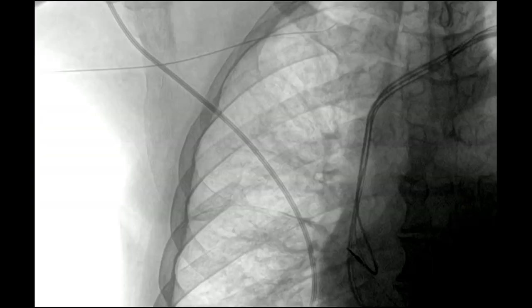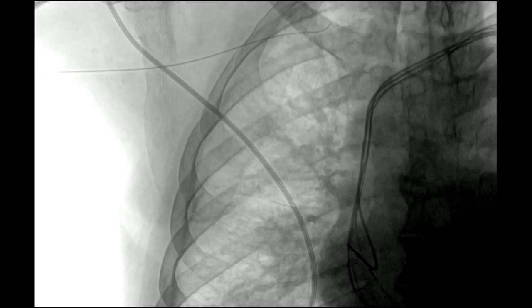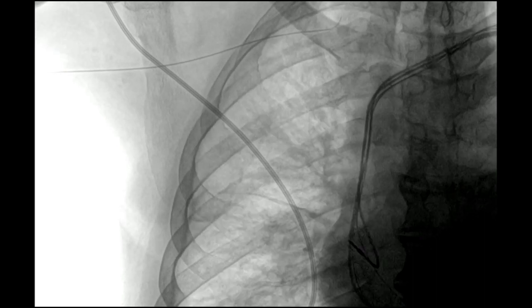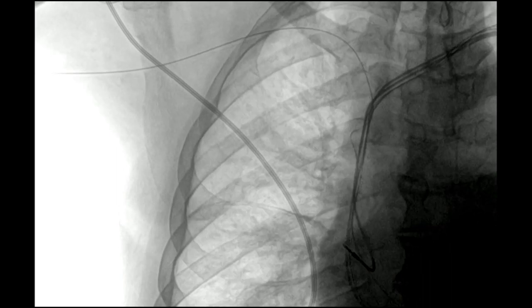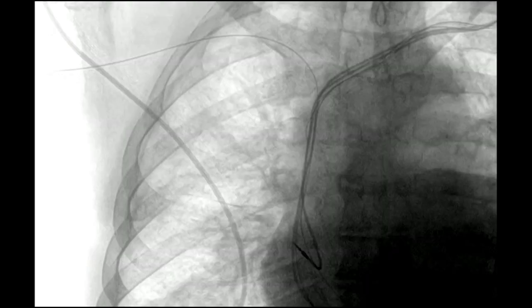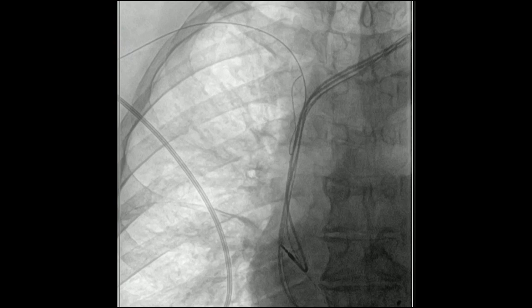The next step is to advance a wire. The sheath is then being placed. The wire tends to preferentially go up into the jugular system — this is the 0.035 angle glide wire. Often you can manipulate this. Here you can see it's going along and buckling at the level of the occlusion. But you can see that the wire actually went through without a whole lot of trouble.